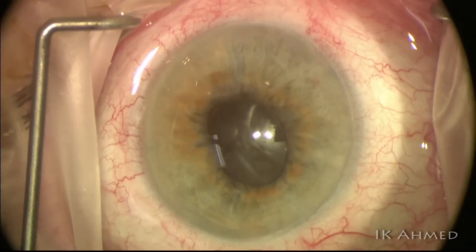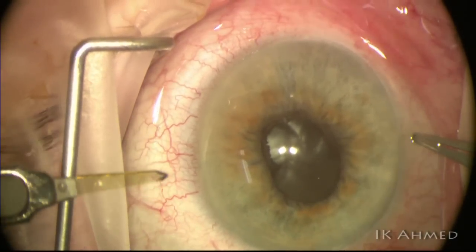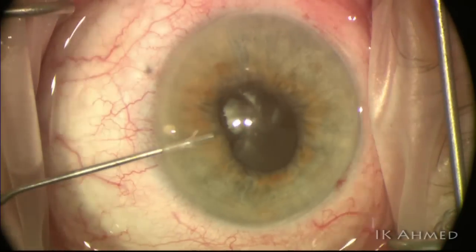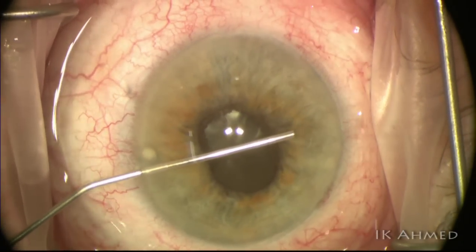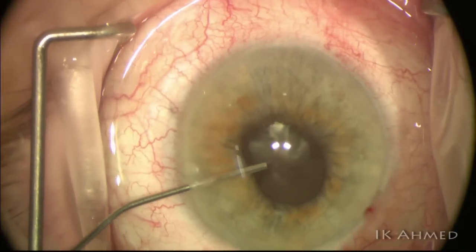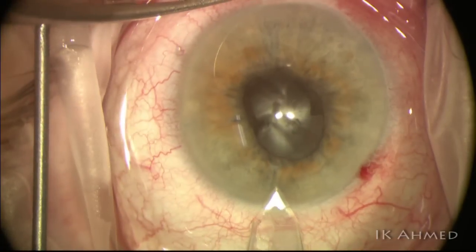This is an 89-year-old patient with a very dense black cataract. You can see the sheen off the lens material and the density of the lens — not just chalky white material but a true black cataract. We're going to start with some dispersive and cohesive viscoelastic injected into the anterior chamber, which is our standard approach.